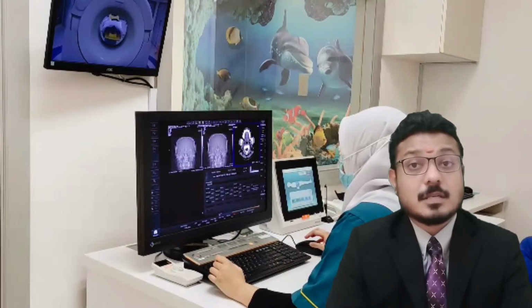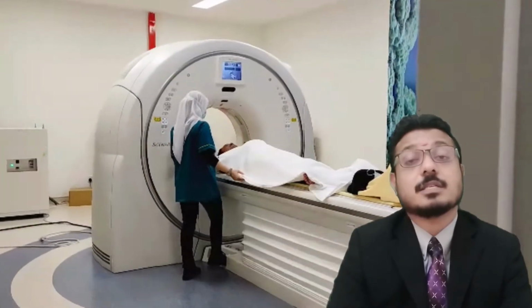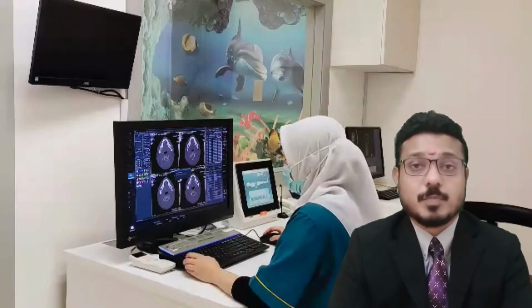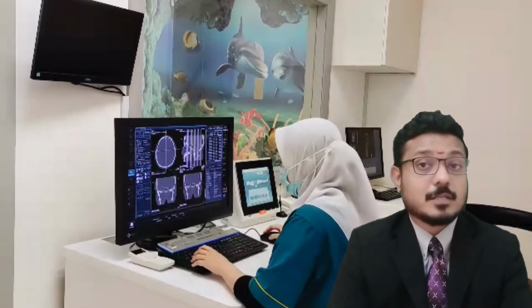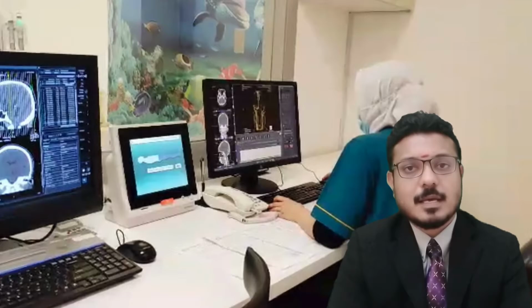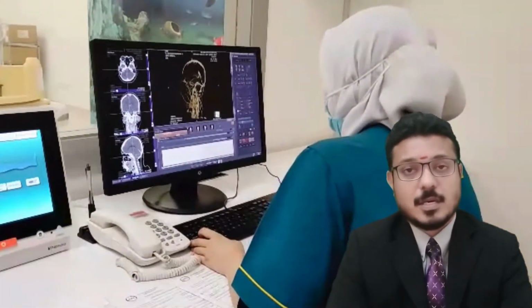The personnel that perform CT scan are called radiographers or CT technologists. Among the roles of the radiographers in CT scan are to prepare patients for CT procedures, operate the CT equipment, provide direct patient care, perform maintenance, and implement continuous improvement procedures.